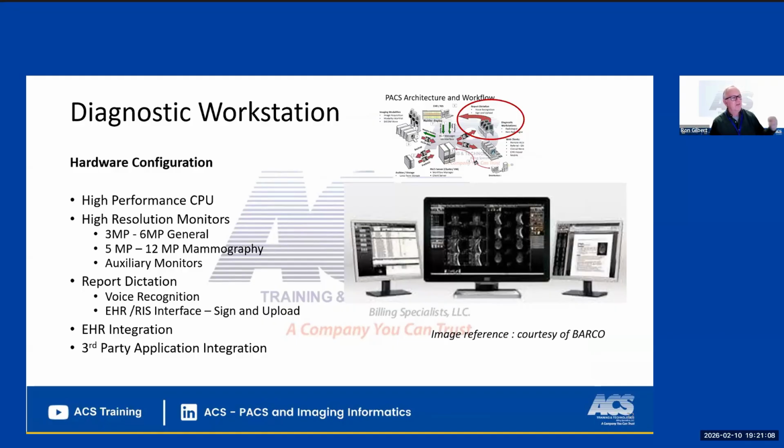They have the electronic health record. Every time they change the image, it's going to change to the page in that next patient's chart. They're going to bring up a dictation window. They're going to be able to fill in the blanks and sign it. And once they're done, it'll go to the next patient. You're going to learn about the hardware and what hardware you need, what kind of CPU performance you need to do this. The vendor will tell you, don't worry, but you will know how to ask for it.